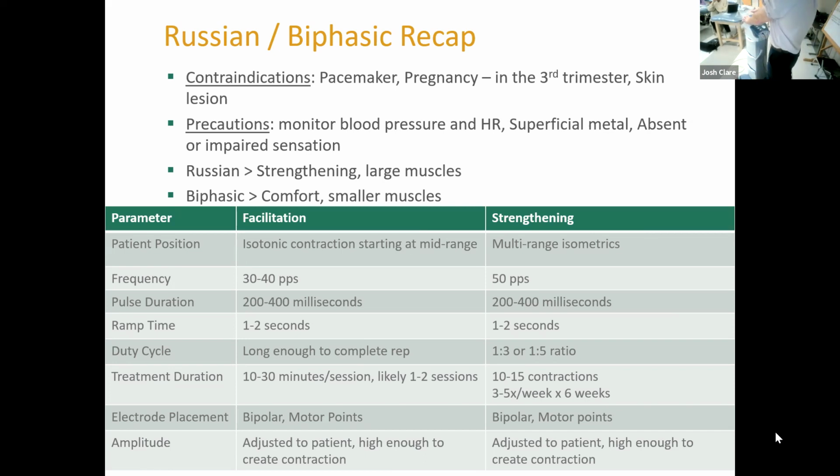For these Chattanoogas, there's a couple different biphasic selections we could choose from. The other selections of biphasic are more for pain relief than anything else. That's not what we're using it for. The button you want to press is VMS. It's in the middle of the screen on the left-hand column. It brings up 3 different categories for us: VMS, VMS burst, or VMS FR. I forget the difference between VMS and VMS burst. I'll look into that in a little bit.